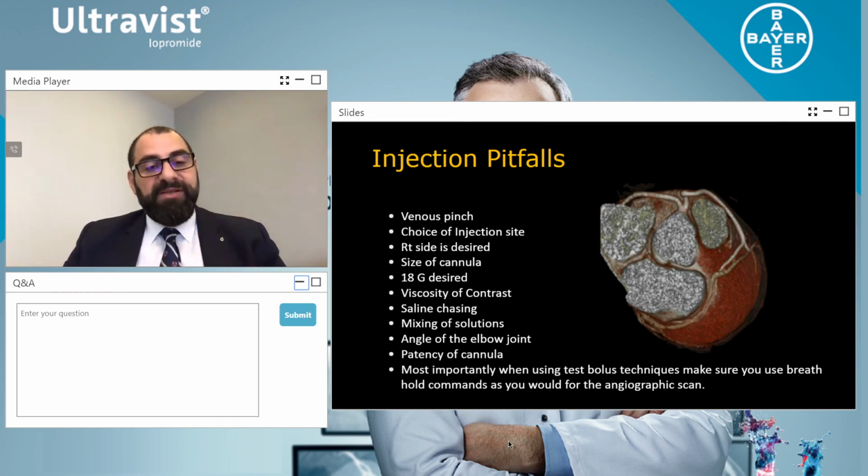Instead of putting their arms above their head, let's get them to place their arms on the CT machine. And so as they move in and out, the contrast is not going to be blocked and will get through really well. The second thing is we always should use a right side contrast injection approach. The right arm is always better than the left arm because the left arm travels a lot further and will mix more with blood than the right arm when it goes to the superior vena cava.